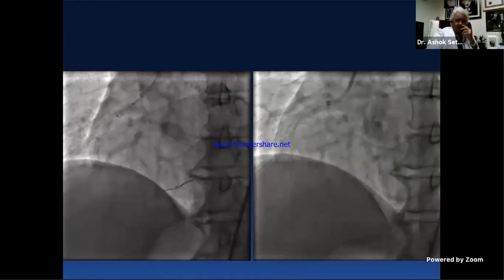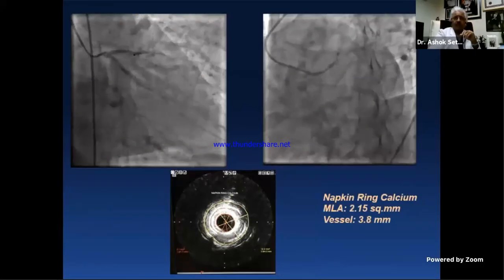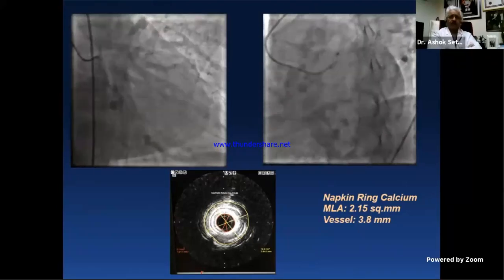And that is, now you get large areas. And that is why we believe that many calcified vessels are under-dilated if they're not imaged appropriately. So it's not just that. And again, I'm not passing it on to the experts. It's for many people in the audience that we continue to.